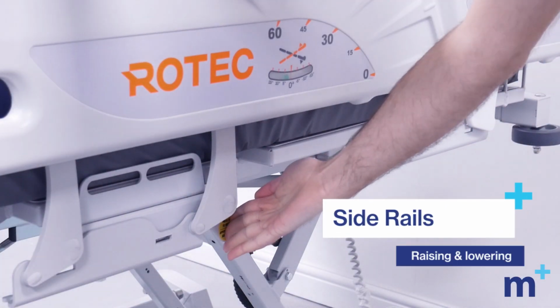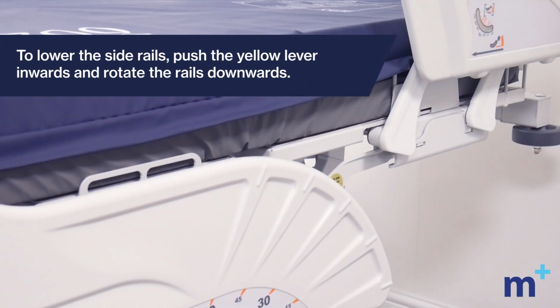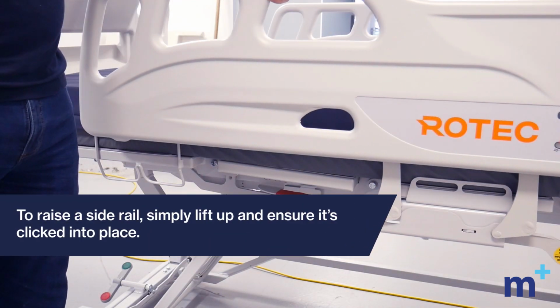The Versatech 700 has 4 easy-to-operate side rails. To lower the side rails, push the yellow lever inwards and rotate the rail downwards. To raise the side rail, simply lift up and ensure it's clicked into place.